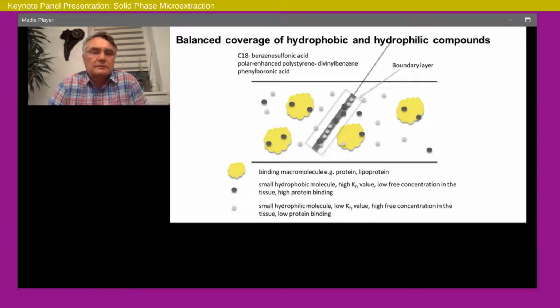So within half an hour or so, or less, when we perform the sampling or blood extraction, whatever, those do not typically reach the fiber. If they reach it, as I mentioned, the fiber surface is impregnated with the polymer, which prevents its adsorption. So by rinsing it, you can get rid of it.